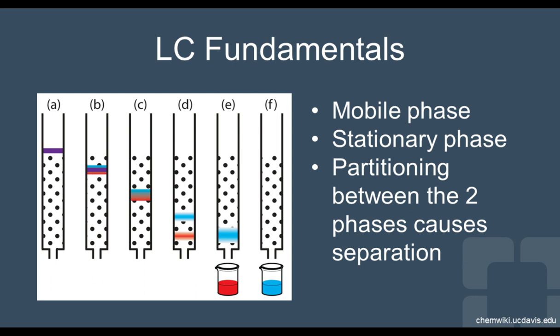Another example, as seen here, is column chromatography, often used in organic chemistry. Here, we have depicted a glass column filled with silica. Silica here is representing a stationary phase. Much like the paper for the pen experiment, this phase does not move. Once the analyte of interest is loaded, here seen as the purple color, a mobile phase is introduced. For liquid chromatography, the mobile phase is liquid, of course. If you change the mobile phase to gas as the carrier, then you're doing gas chromatography.